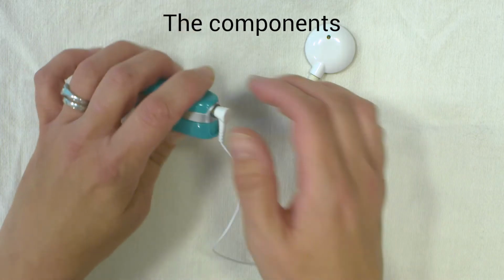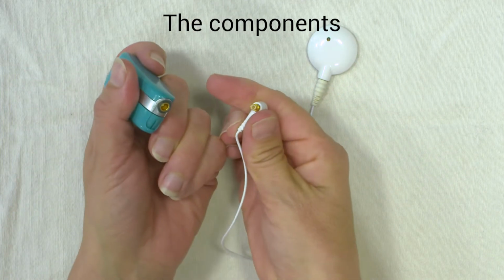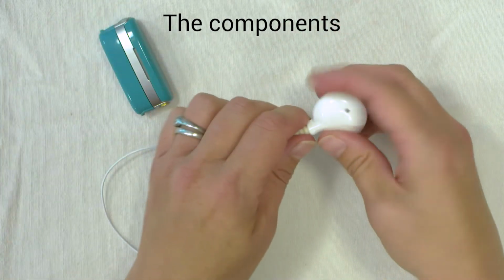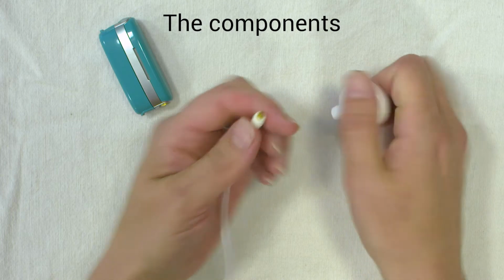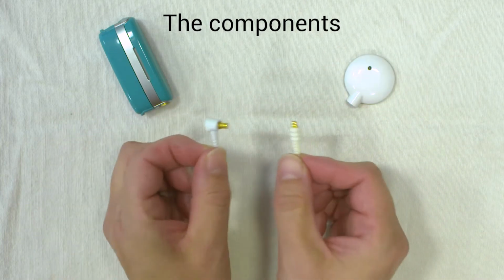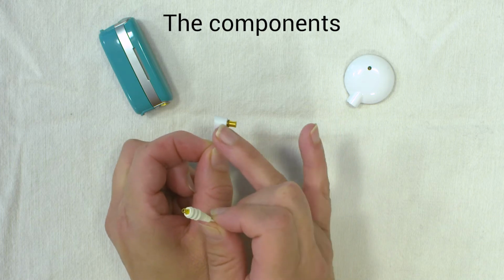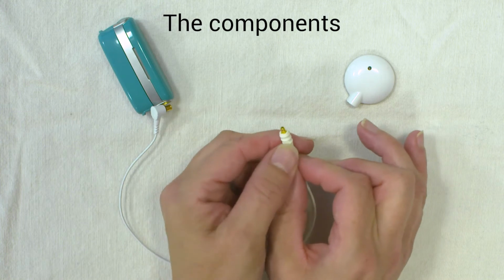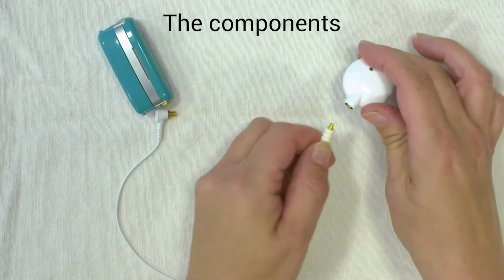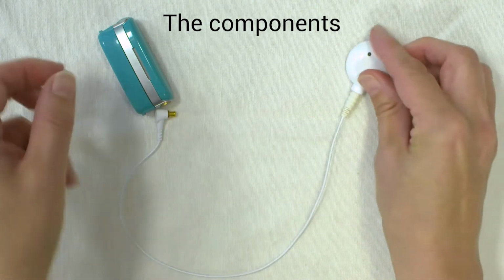The lead can be pulled out of the processor like so, and the other end from the coil like so. You can see that there's two different shapes. So the bent one goes in towards the processor and the straight one goes in to the coil, and you literally push it in and click.